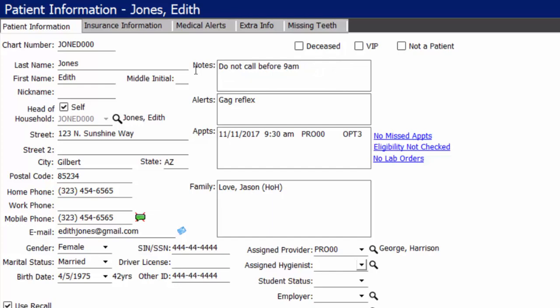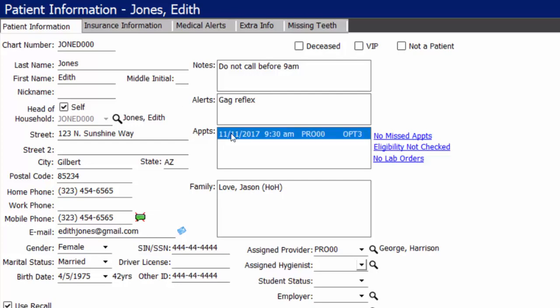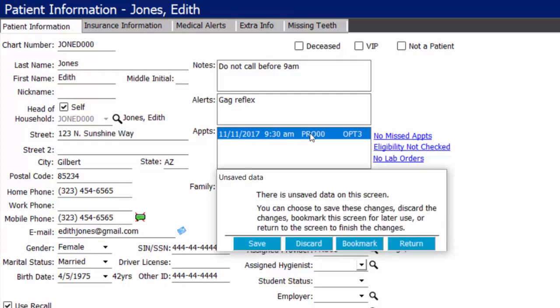Each appointment note is specific to only the appointment it's attached to. You are able to replace these notes with standing notes that may be more relevant. In the alerts box, you do have a free form space where you can type out anything super important that you want to pop up when you open that patient's file. Any appointments the patient has will be listed here, and this is an interactive appointment — double clicking it will take you directly to the scheduler. The system will automatically prompt you when you're trying to move forward to a different screen without saving your changes, giving you the option to save them now, discard your changes, cancel, bookmark your screen, or return and continue making changes.